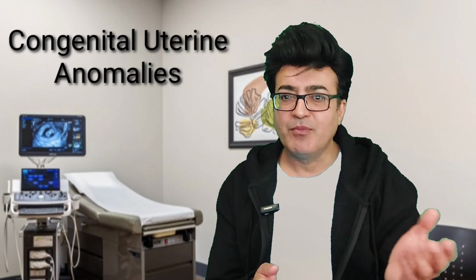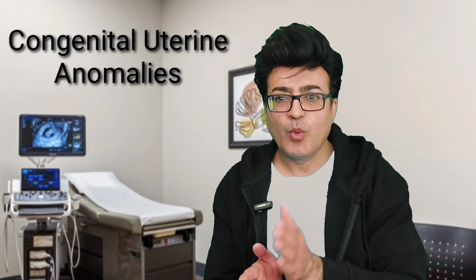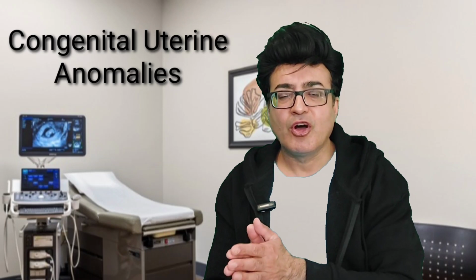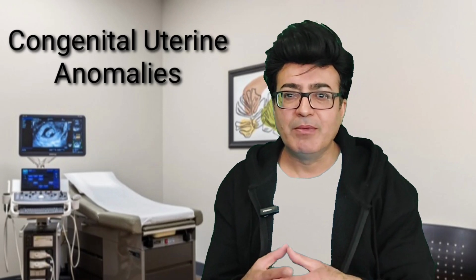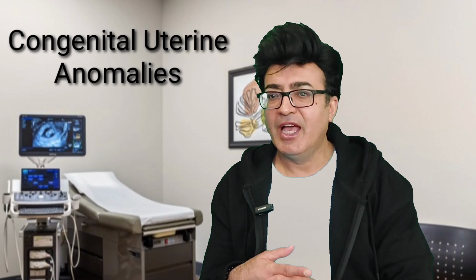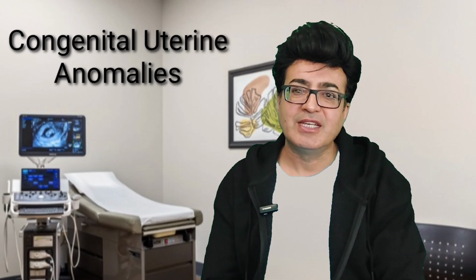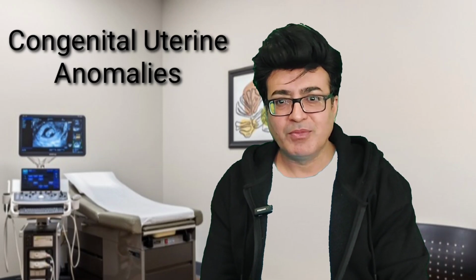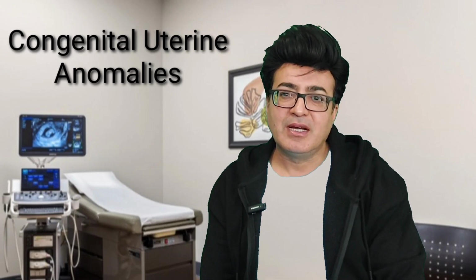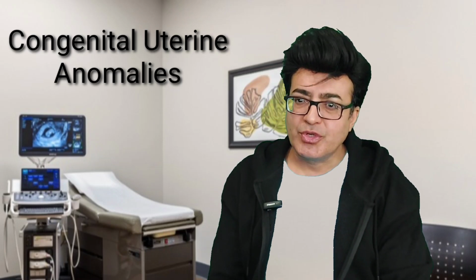Sometimes there will be a subtype which I will discuss in this video, but believe me, if you just go one by one and understand this is because of this issue, I'm sure you will be able to understand this on the ultrasound imaging and on the MRI, and it will be no longer difficult for you to identify the congenital mullerian duct abnormalities.